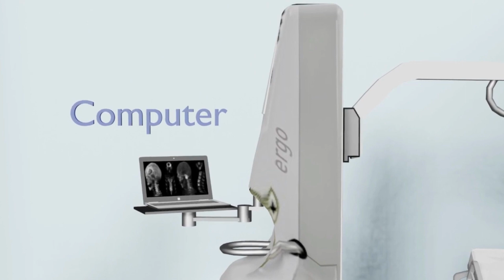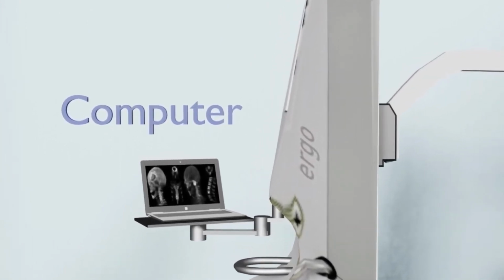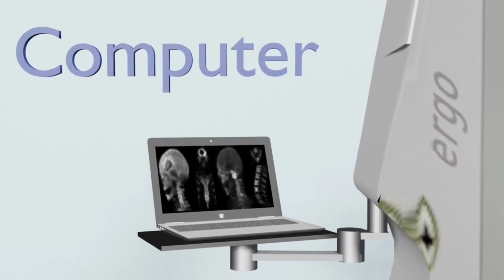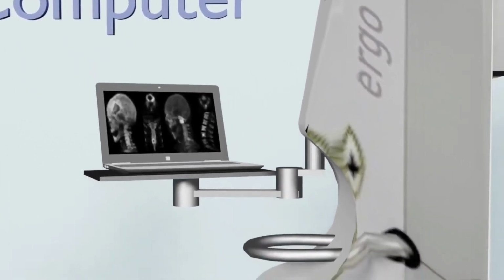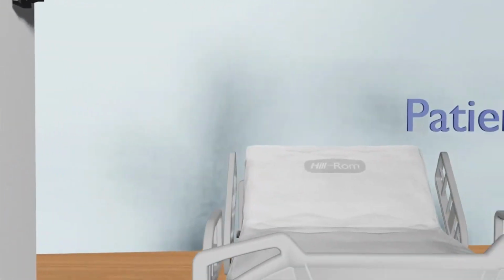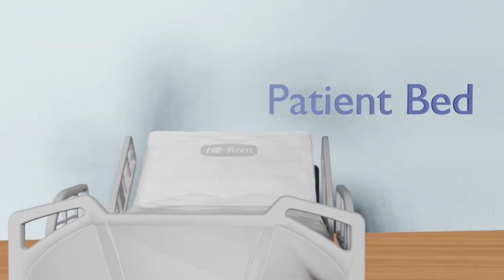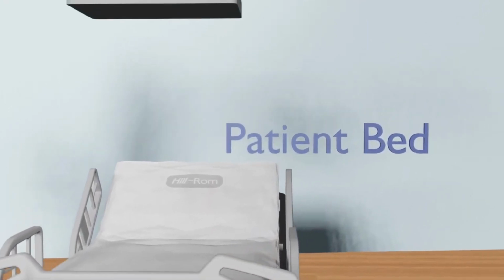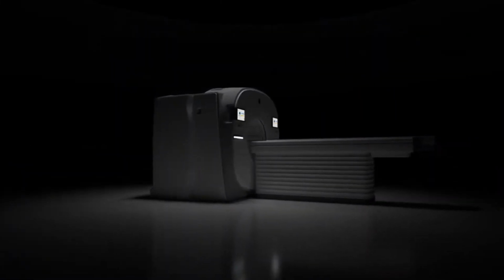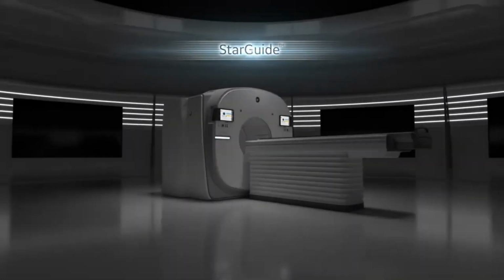The mobile gamma camera scans the body by injecting a radionuclide in the body or organ and records the resulting radioactivity by using gamma cameras. Image acquisition in the mobile gamma camera is done in just 2 minutes. The complete examination of the patient, from the time of the injection of radioisotopes to the final image acquisition, is done in 10 minutes. The second type of camera is a SPECT gamma ray detector with computed tomography.